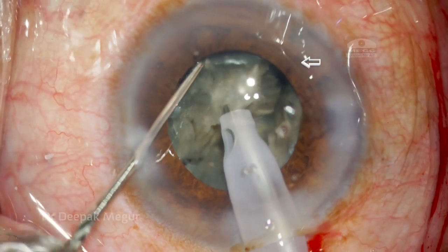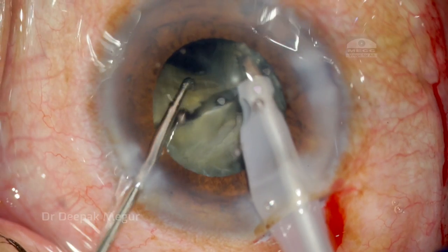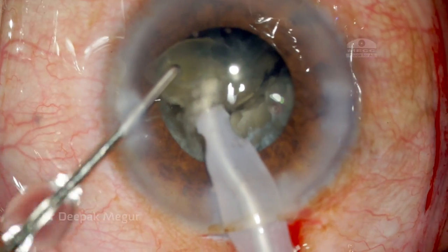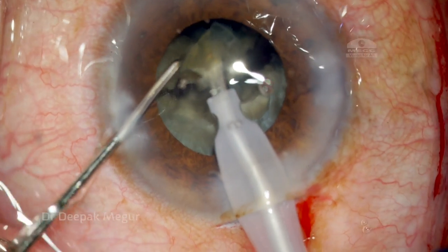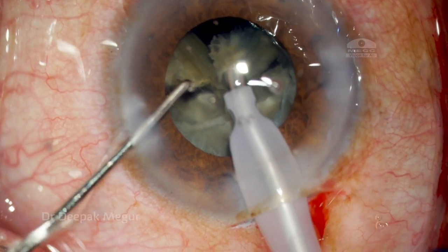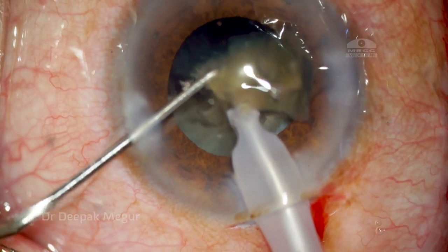I'm trying to laterally separate this fragment and I'm feeling something unusual. I pull the nuclear fragment much more anteriorly and then try to emulsify it. Momentarily it looks all right — I'm able to emulsify about one third of the nuclear fragment — and at this point I notice that something has happened.